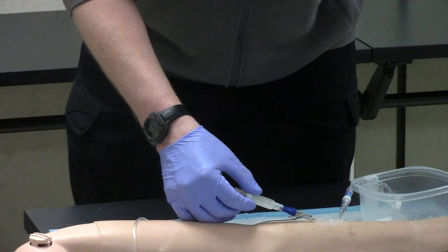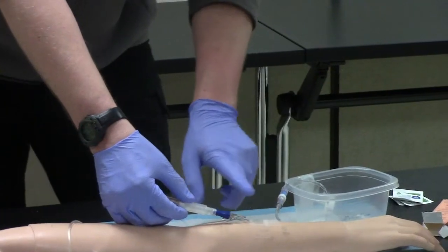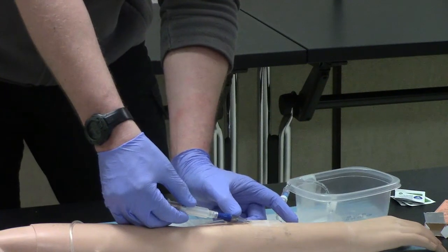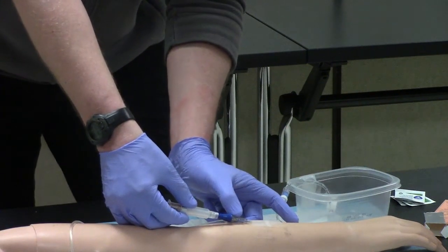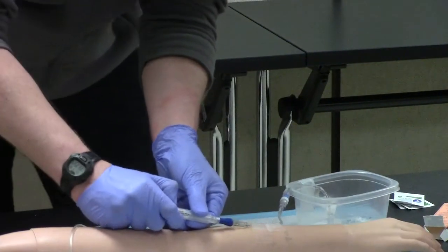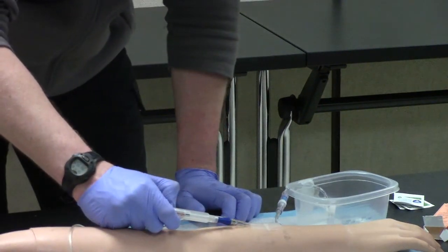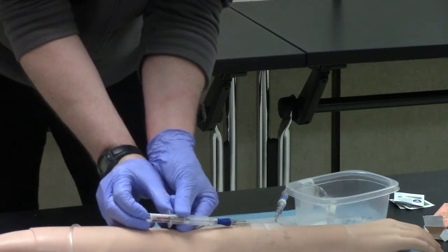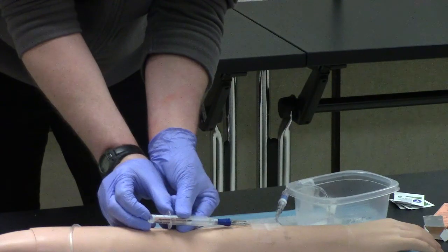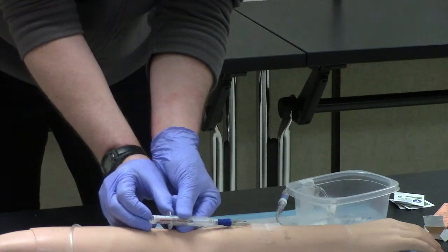Now I know your sheet says to stop the flow. However, with Narcan, because it's a slow push medication, if I stop the flow, the medication is going to be trapped here and never actually make it to the patient. That makes it very difficult to watch for effect. So with Narcan, I'm going to leave the drip set going at TKO and slow push my medication, like I said, over 15 to 30 seconds, watching for patient effect. In this case, I would hope to see that my patient's breathing becomes better and they regain some consciousness.